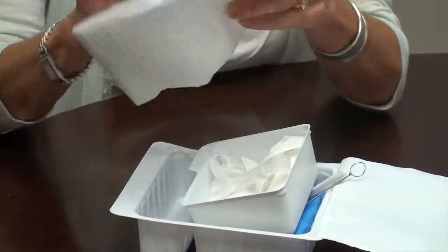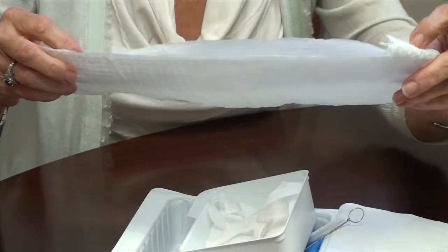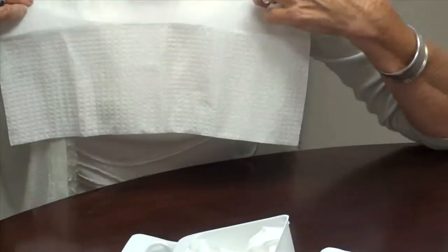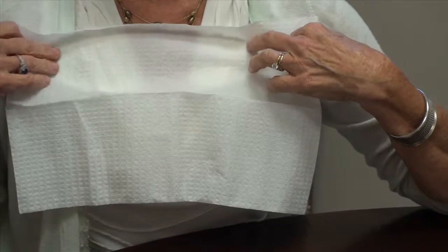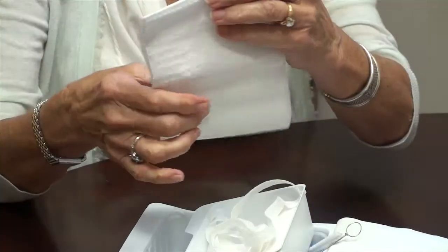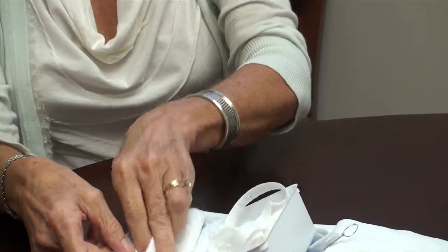On the other side is your actual barrier that you would put on the patient's chest around the trach to keep things nice and clean — just like that. So that's what the inside of the tracheostomy care kit looks like.